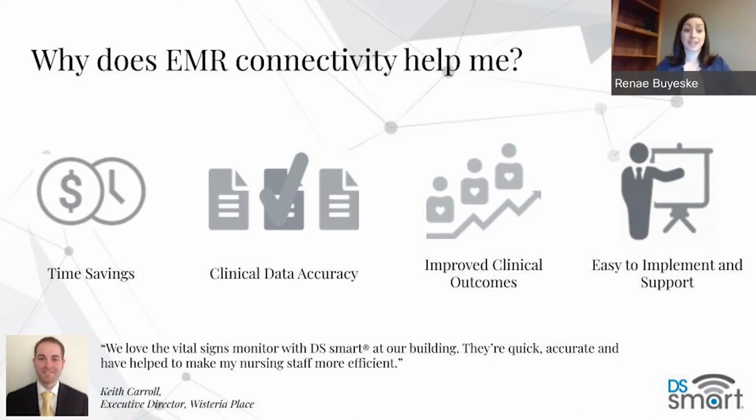Both of those things together, the increased time savings and the increased accuracy of the actual clinical data, will lead to better and improved clinical outcomes, giving you more time to do different activities and things with the residents, getting that information real time for physicians to make real time decisions based off of care that's needing to be implemented, can all help and provide some of those improved clinical outcomes.